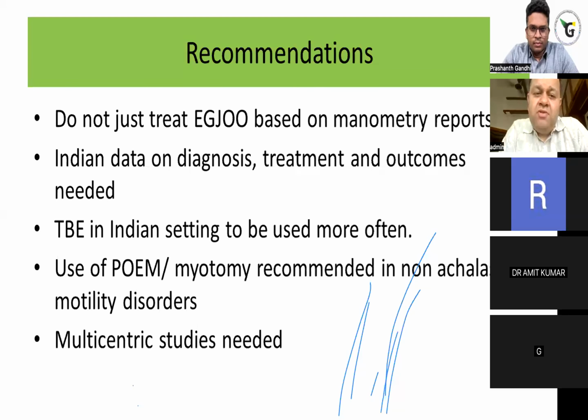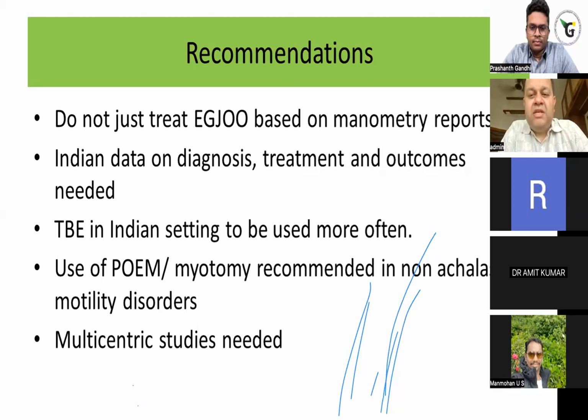So we should not treat EGJ outflow obstruction only based on manometry reports. It is very, very important. You have to have a multimodality approach to diagnosis and management of EGJ outflow obstruction. Look for clinically relevant symptoms and substantiate your findings with a timed barium esophagogram.